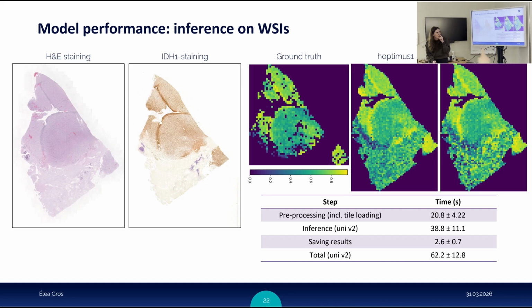Next one. So all the statistics you've shown are basically on a patch level. But in this image, you see the context, right? These patches are really tiny by comparison with the size of the whole slide image. And I wonder, especially when you talk about a mean average error of, I don't know, 6% or something like that, the interesting statistics are probably not patch by patch, but something less granular than that.